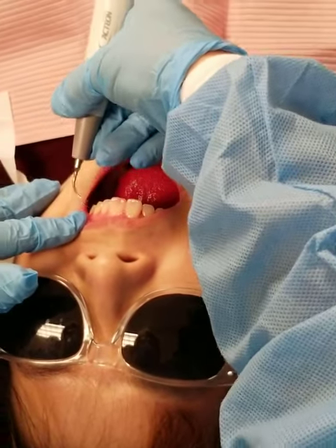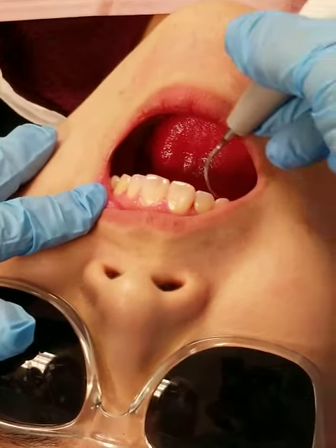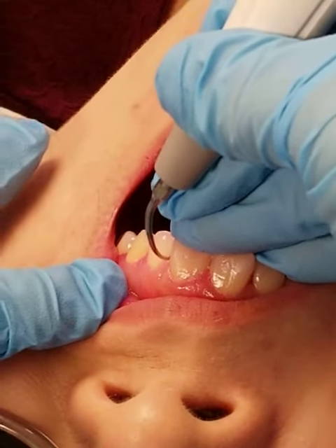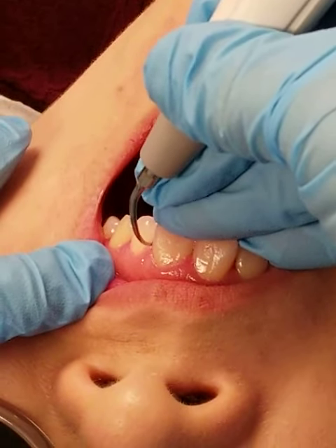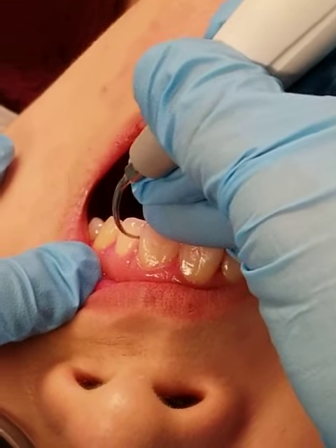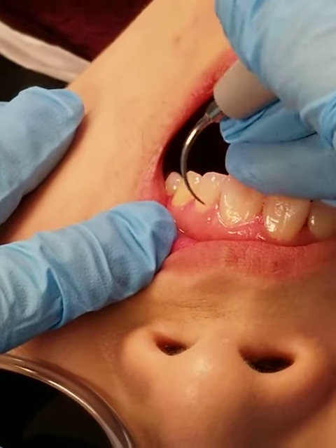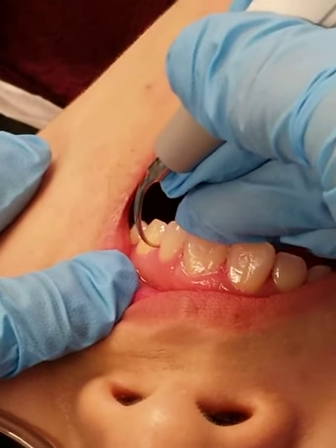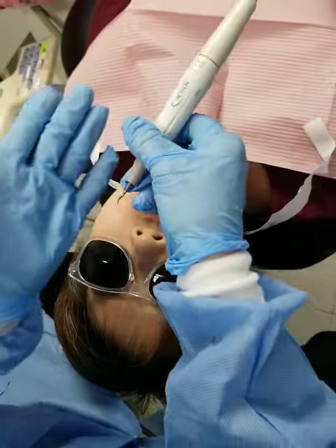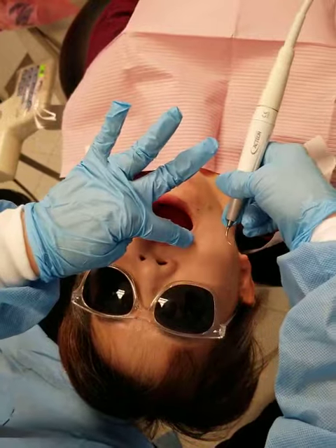This end is for your upper left buccal — it'll also work for the upper right lingual. The way you're going to use it is exactly like your scalers. That tip is going to be pointing right towards the tooth you're working on. It's going to be a very fast movement, just like you're erasing something off a piece of paper. There's no reason to do a lot on the buccal — mainly focus on the interproximal. Whatever tip is good for this side, the other curved tip will be good for that side.